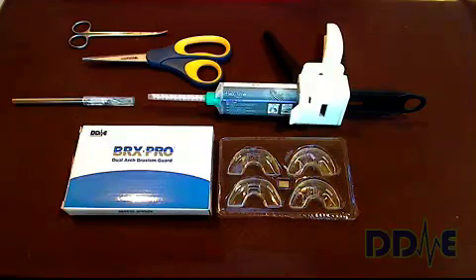Welcome. Today we're going to learn about how to make a BRX Pro dual arch bruxism guard. Before I get started, I wanted to mention a few of the unique features of the BRX Pro.